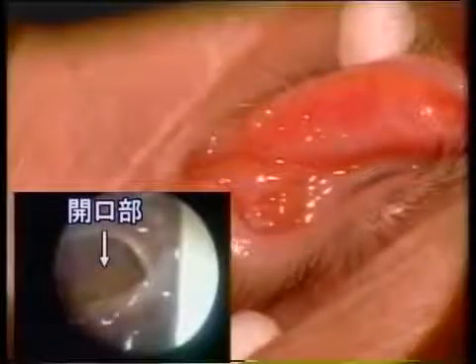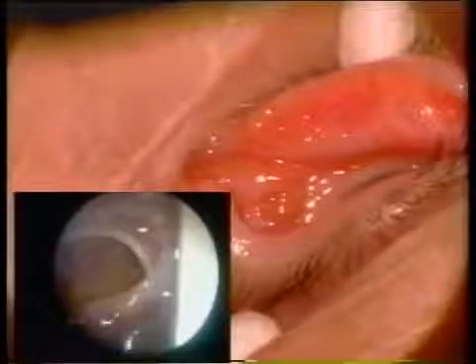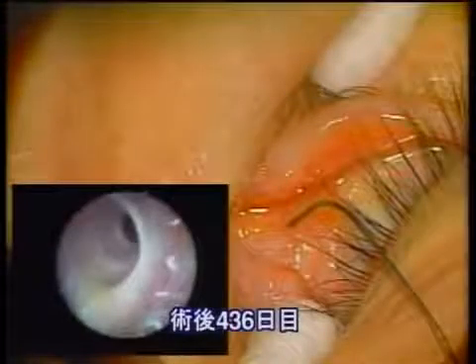The nunchuck tube is taken out 70 days postoperatively. The removal process is very easy. A big rhinostomy including the natural opening is created.